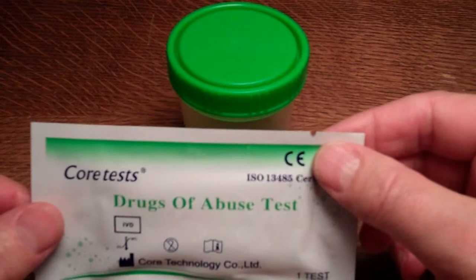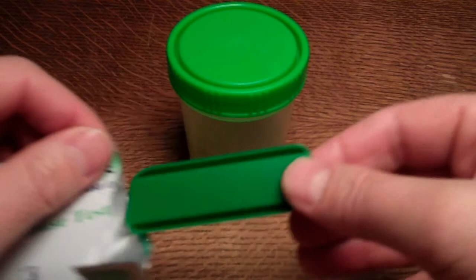The test procedure is extremely easy. Remove the cassette from the foil and on the reverse of the foil, you have the test instructions and how to interpret the result.